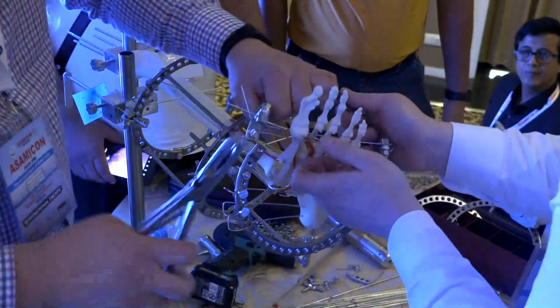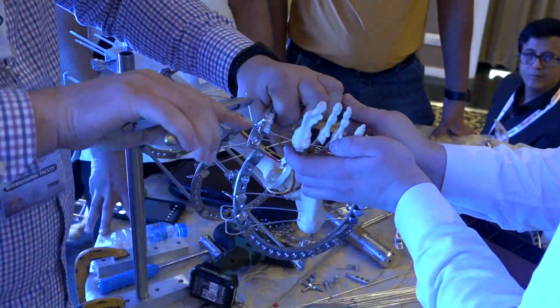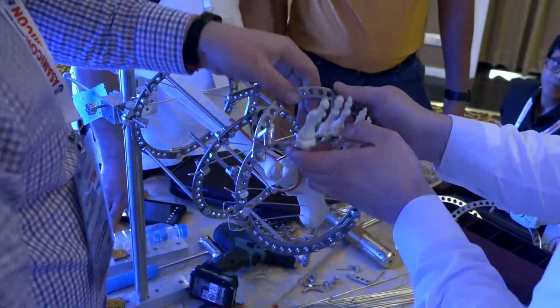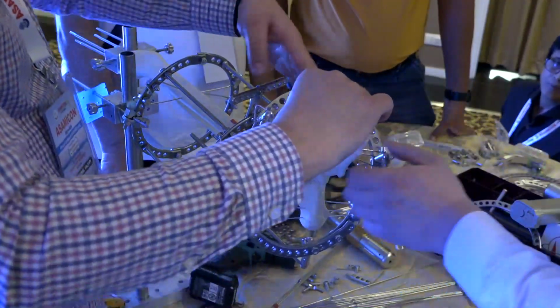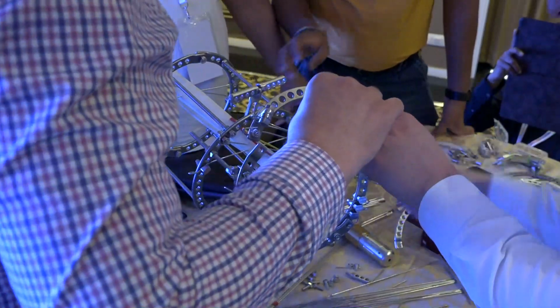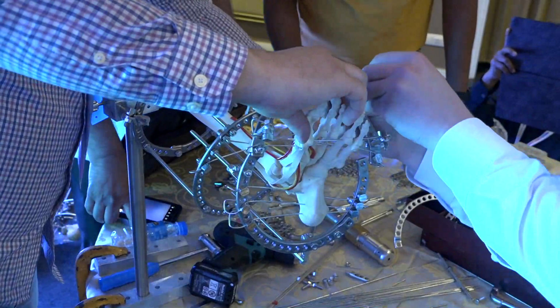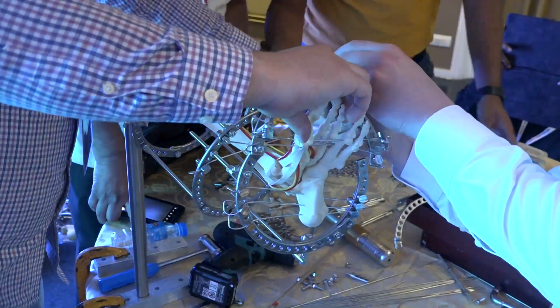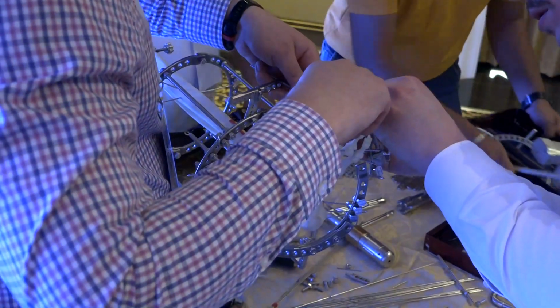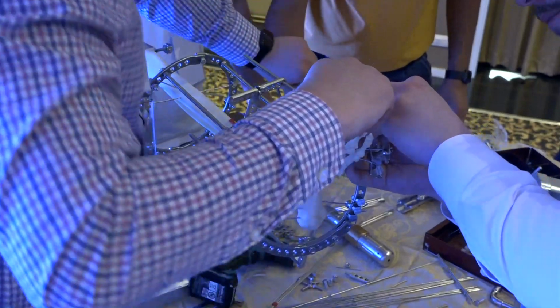And now, the last step is to put twisted rods on and fix the forefoot with hinges. Long rods, yeah.